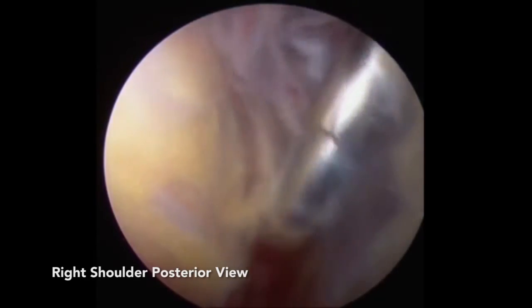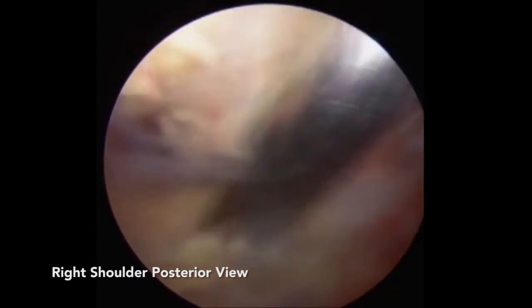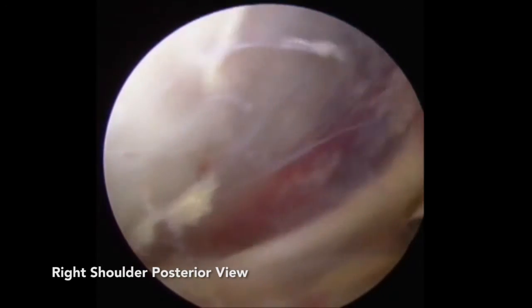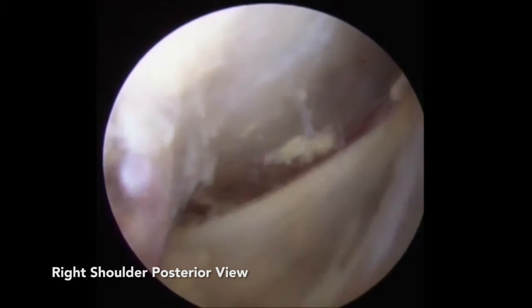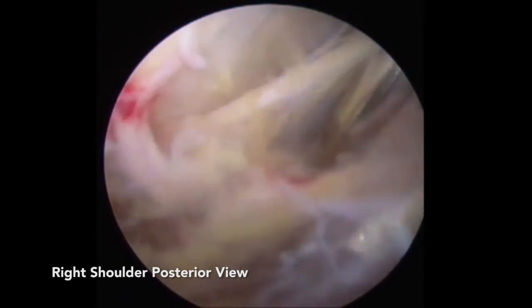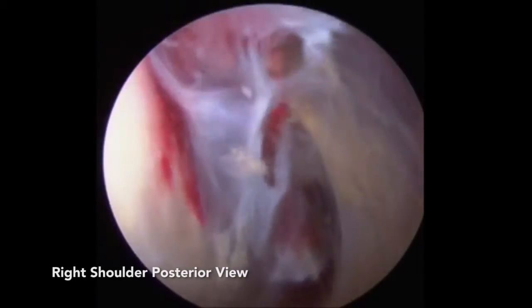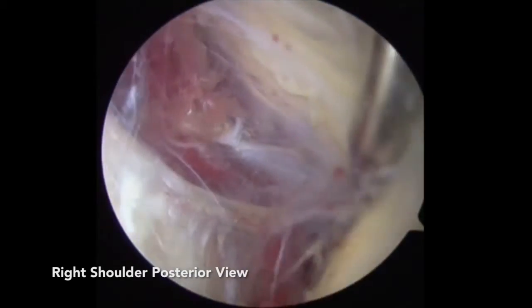With the arthroscope in the posterior portal, a mechanical shaver is used through the anterolateral and lateral portals to debride the subacromial bursa and any adhesions. Being cognizant of the inferior depth at which one is working is important in avoiding iatrogenic injury to the axillary nerve. The viewing and working portals can and should be alternated as indicated for appropriate visualization and instrument trajectory. A combination of blunt dissection and electrocautery is utilized to release adhesions and connective fascial bands. Once the nerve is encountered, it is bluntly dissected from adhesive tissues until it is adequately liberated.